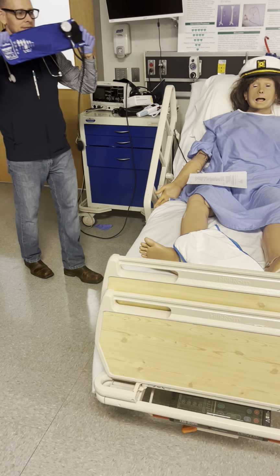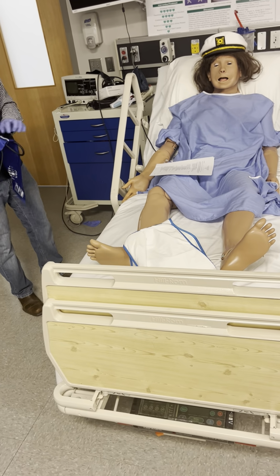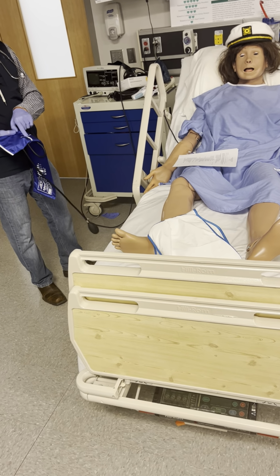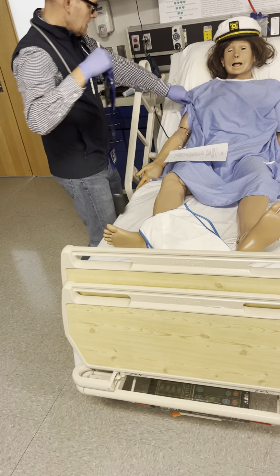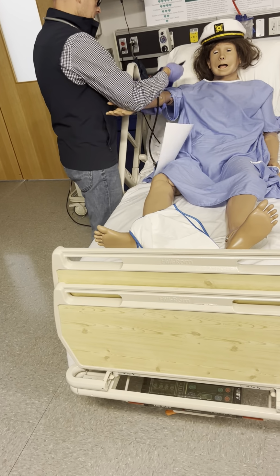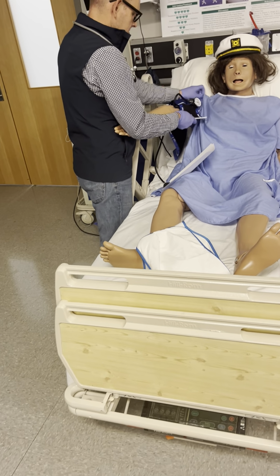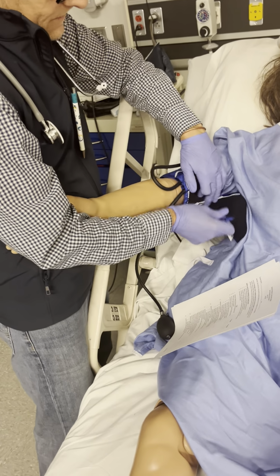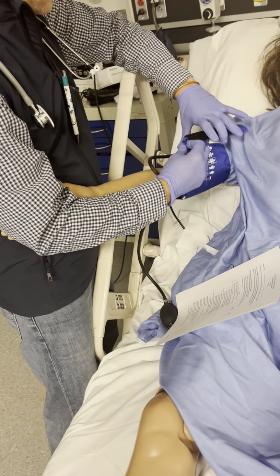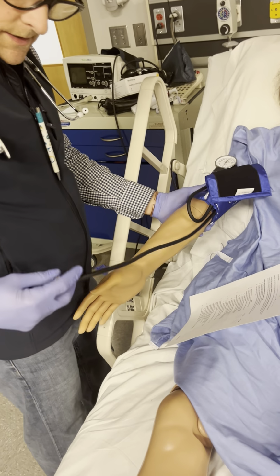Most importantly is it's the appropriate size, right? This is gonna fit her right. I've got an artery mark here. I want to place this right over her brachial artery. Extend that arm, place it over her artery, nice and not too tight, but I don't want to leave a lot of airspace in there either. Okay, I left enough room for a stethoscope under there.